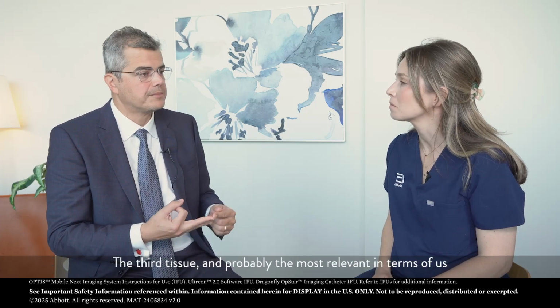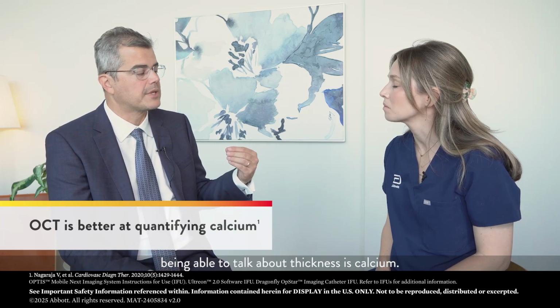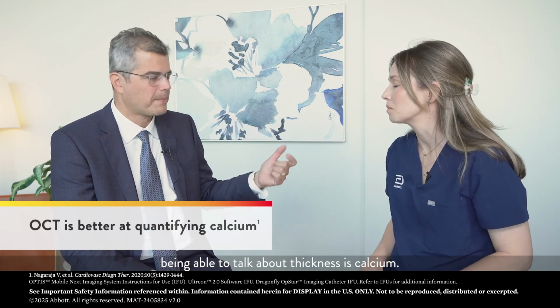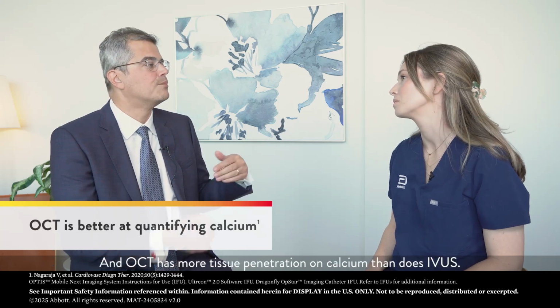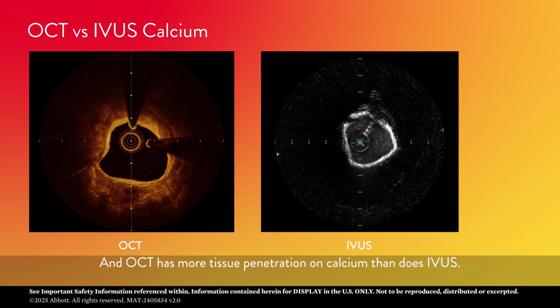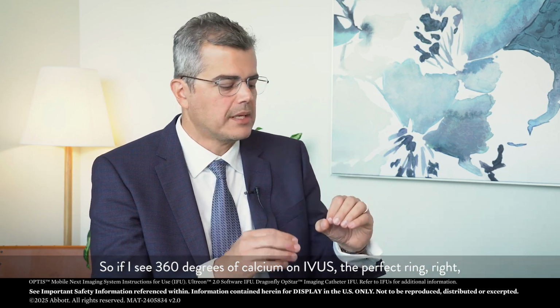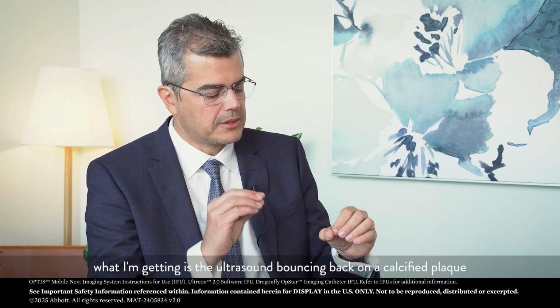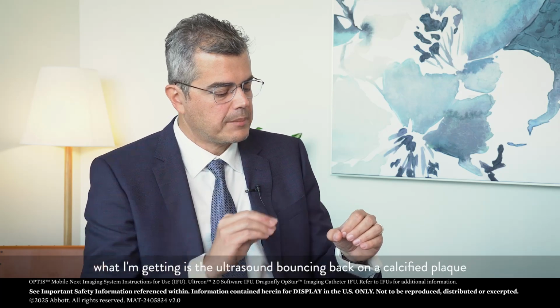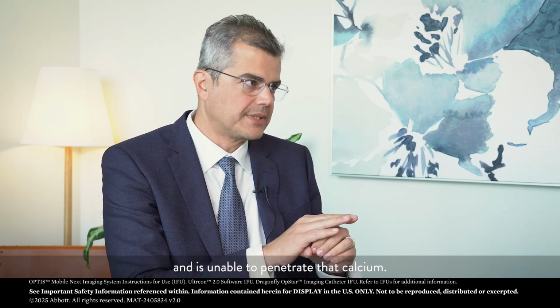The third tissue, and probably the most relevant in terms of us being able to talk about thickness, is calcium. And OCT has more tissue penetration on calcium than does IVUS, right? So if I see 360 degrees of calcium on IVUS, a perfect ring, what I'm getting is the ultrasound is bouncing back on a calcified plaque and is unable to penetrate that calcium.